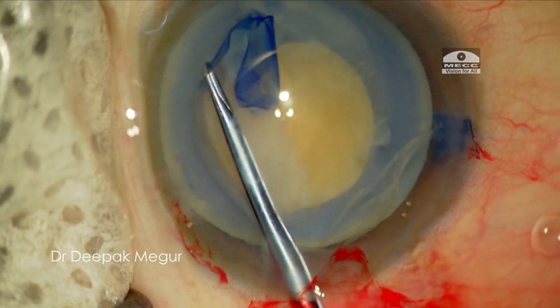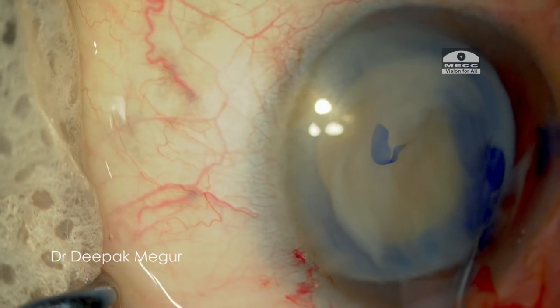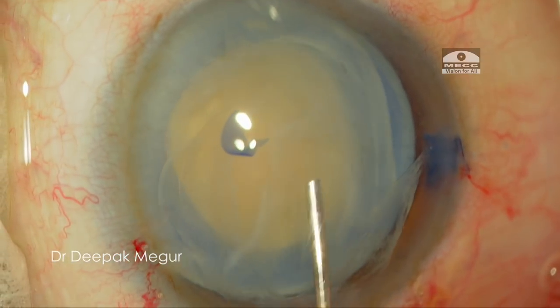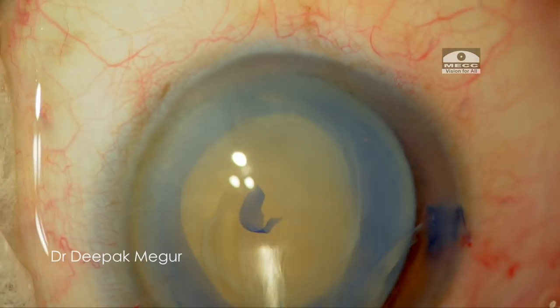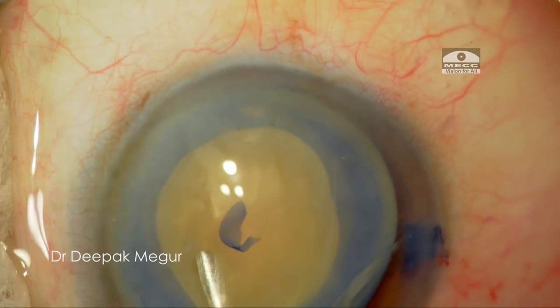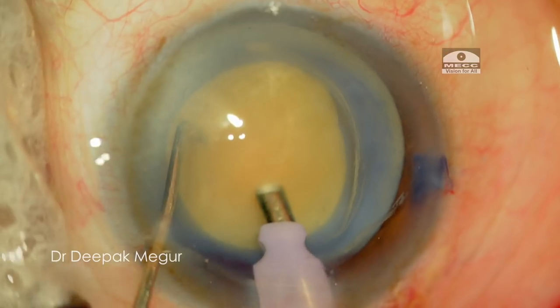This is a slightly denser nucleus. The most important secret to achieve a successful chop is always to have a firm grip at the core substance of the nucleus. A slightly bigger or bulbous phaco tip makes things much easier to grip the nucleus. However, it is slightly tricky to work with these slightly thinner tips.